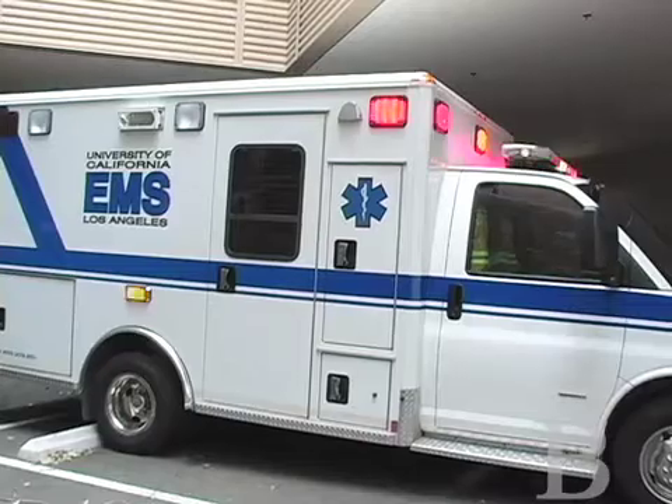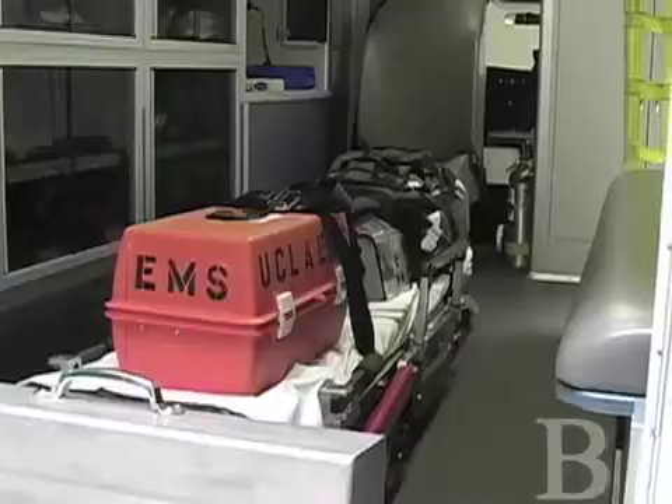This is EMS-1, our primary ambulance. Here in the center, we have our gurney. Every single call that we go on, we pull the gurney out and take it with us on scene.